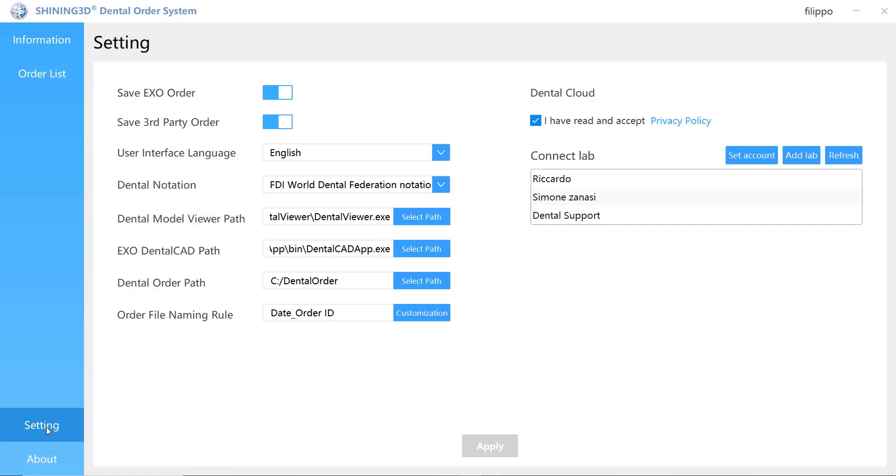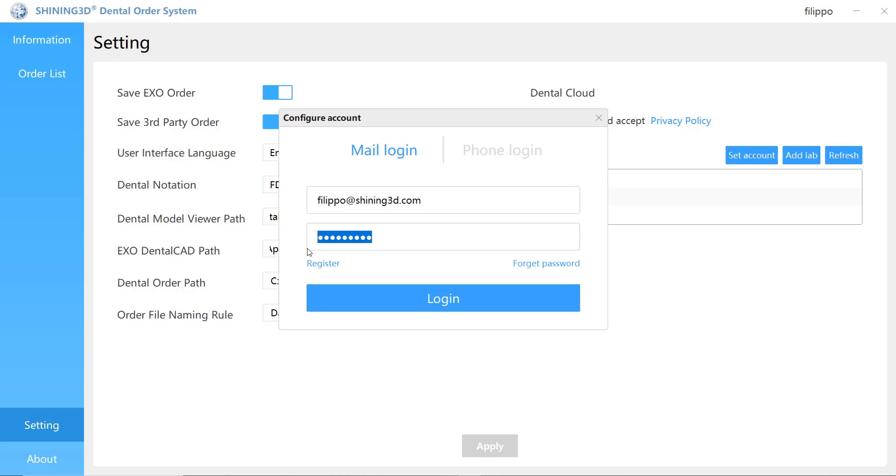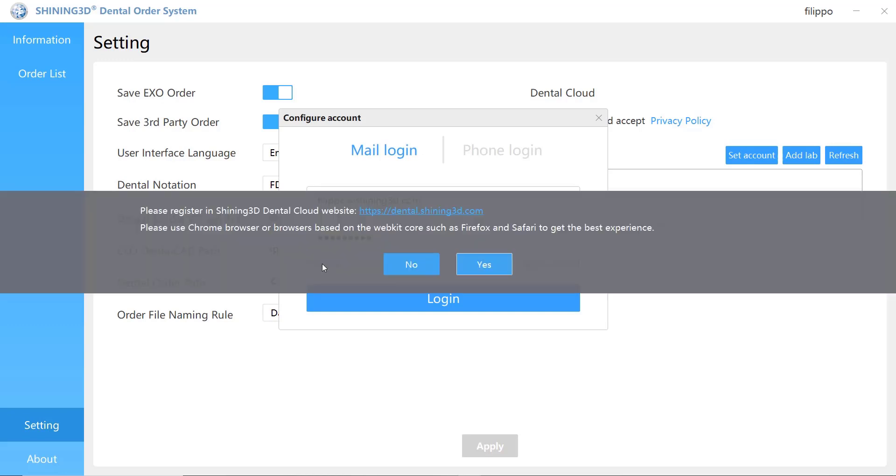Another way to create a new account is to click on settings in the Shining3D Dental Order System, then register.